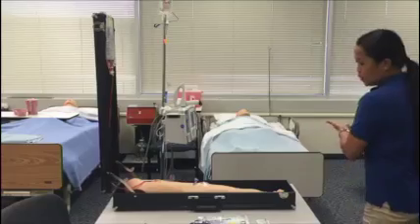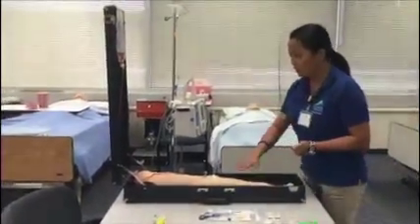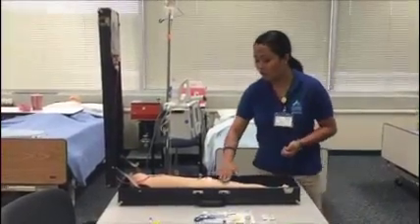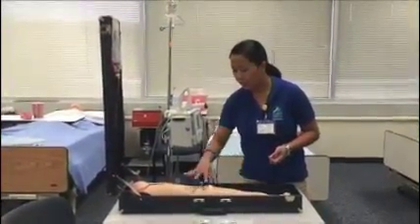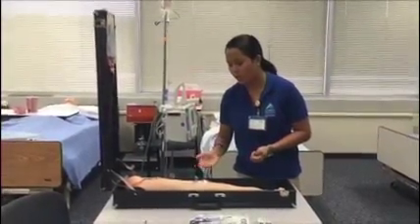So I'm going to check the IV site to see if there's any inflammation or anything wrong with it. It seems like everything's fine. There's no inflammation, no redness or anything.